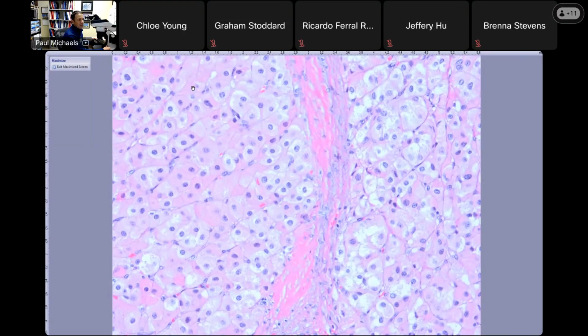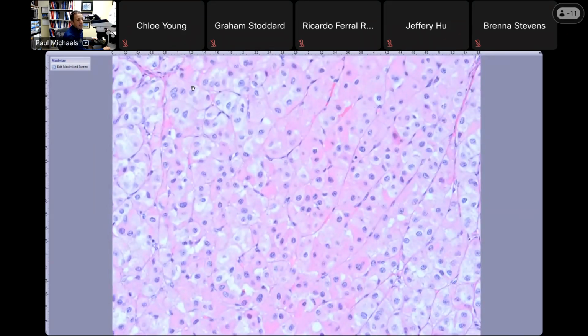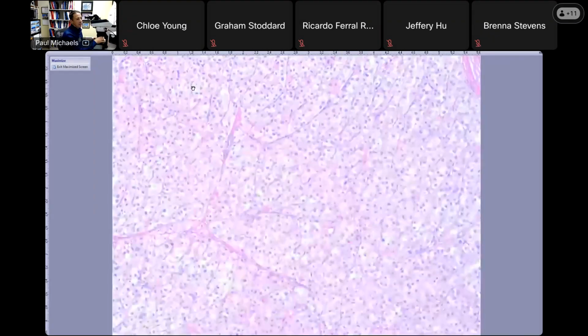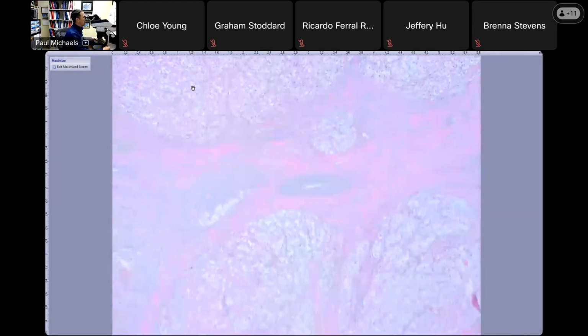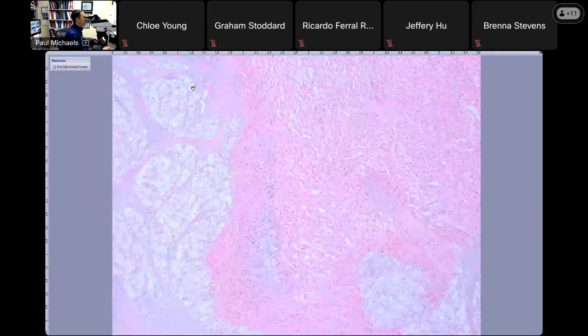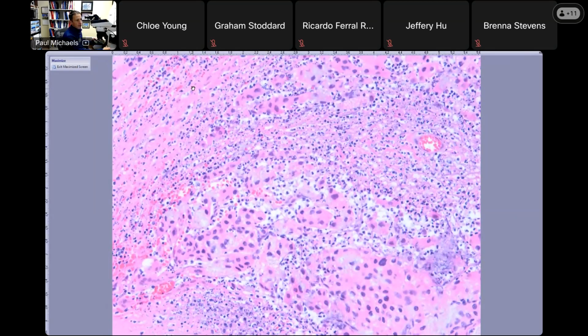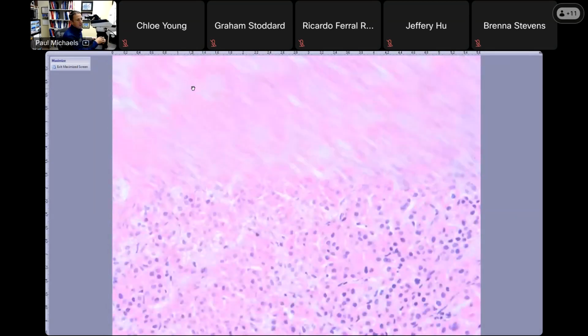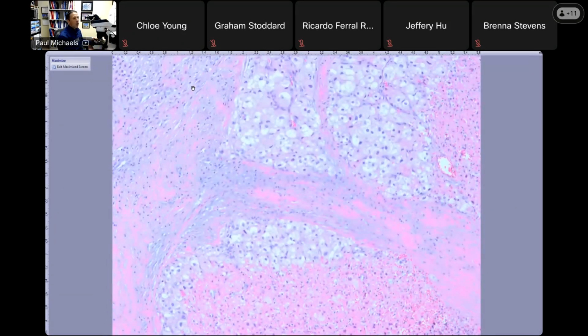So I got a Ki-67 and it was 15%, which is much higher than the 5% cutoff. So I suggested that this is likely an adrenal cortical carcinoma, and then they took it out and it's clearly adrenal cortical carcinoma. There are areas of necrosis here. The growth pattern is just not consistent with anything benign. Here's some necrosis that was not biopsy site change. Remember, they had a biopsy. You have to be careful of that. So this is one of the blander adrenal cortical carcinomas where Ki-67 for me on the core biopsy was very helpful.